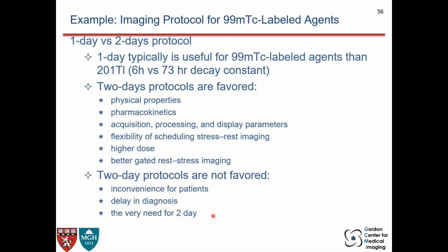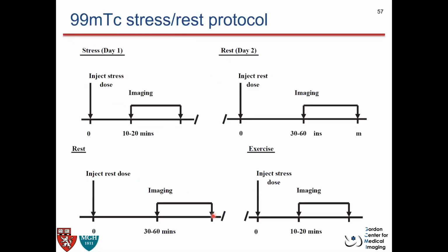And the fact that you need 2 days of imaging, again, for hospital utilization and camera time block, these are not very favored. Just an example here. There are different protocols. Obviously, this is not very generalized to all imaging applications, but this is just one example.